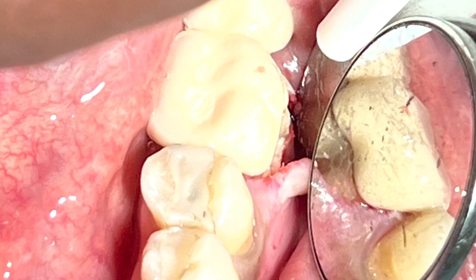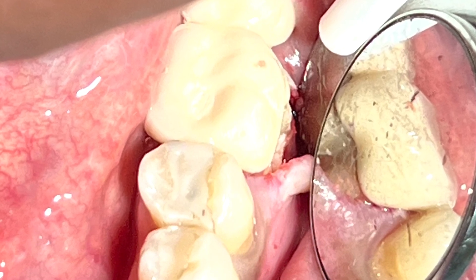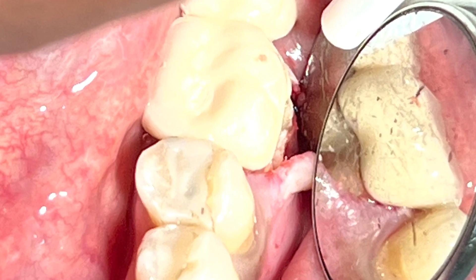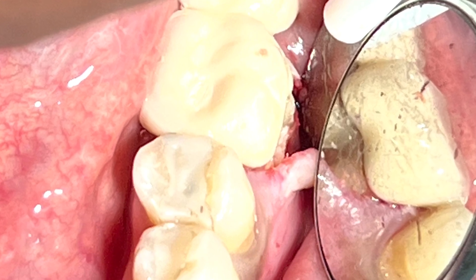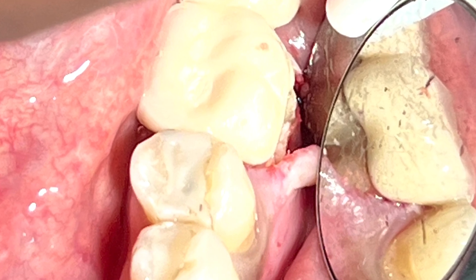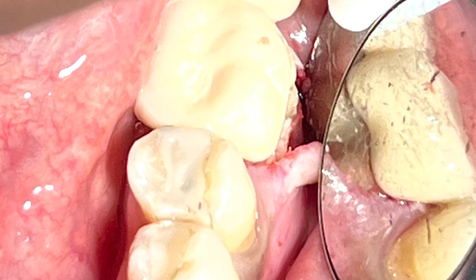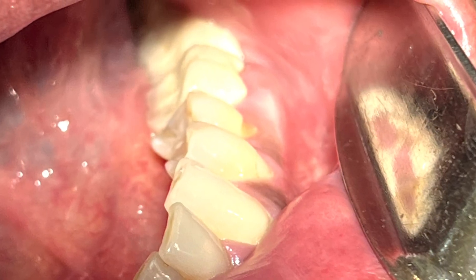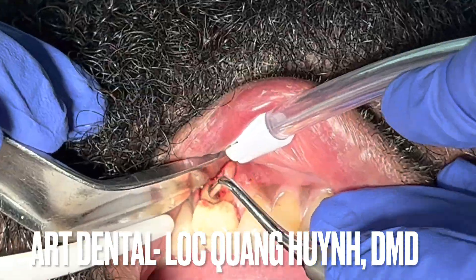I couldn't see it at first, but when I used a mirror and reflected it, I was able to see the vertical fracture line from the margin of the crown down the mesial root all the way to the apex. This is the reason why there was furcation involvement as well as the chronic pain the patient experienced for the past several weeks. I believe the decision to remove the tooth is the proper one.